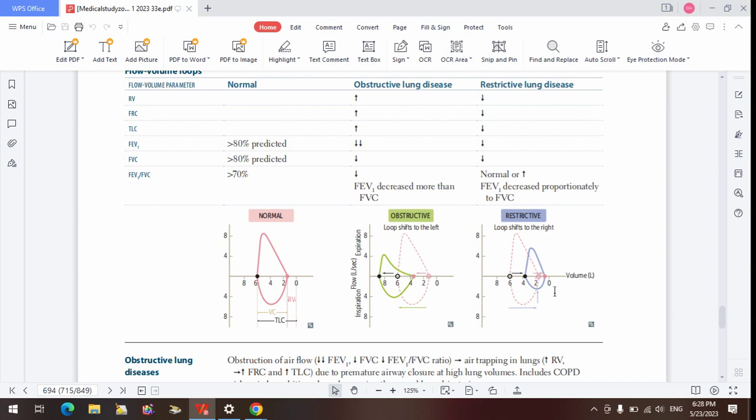So you guys can see this person here starting at around maybe 0.8. The person taking in the air, getting it to 4, cannot get it to the maximum lung capacity. The maximum lung capacity in this person is likely to be around 4, right? So this person's total lung capacity is 4. So the vital capacity of this person will be like 0.8 minus 4. That's still lower than normal. Then you can see that the peak is also reducing both in inspiration and expiration.